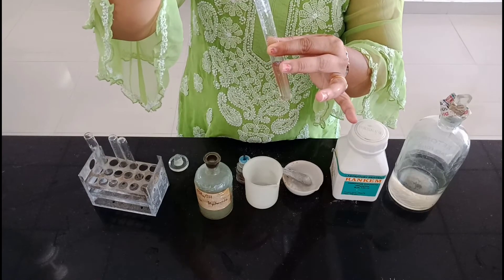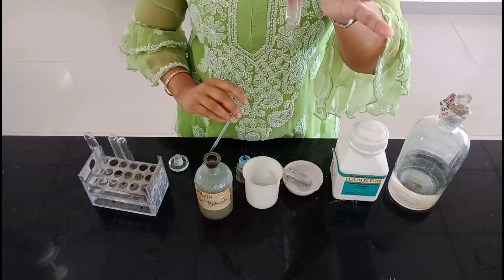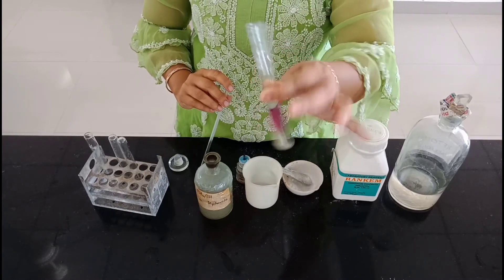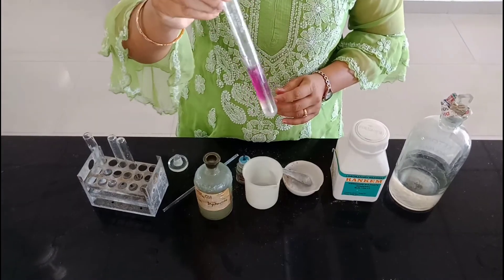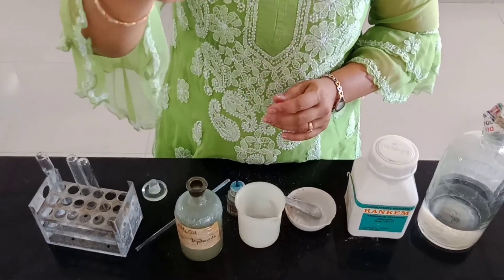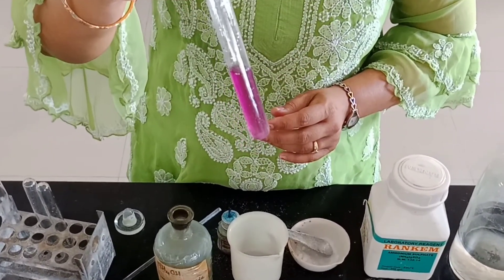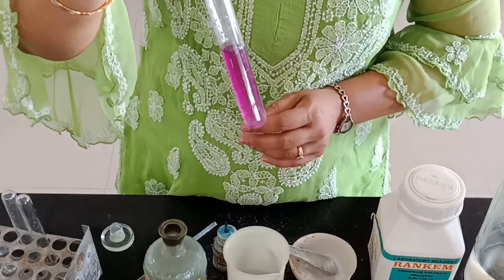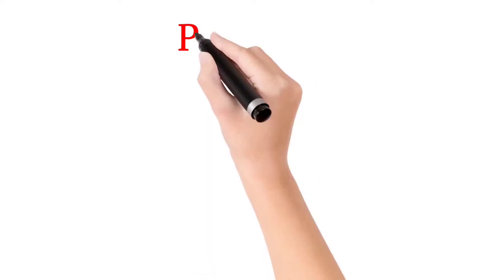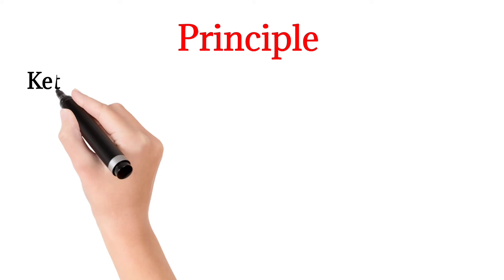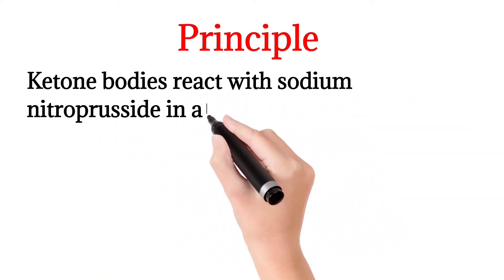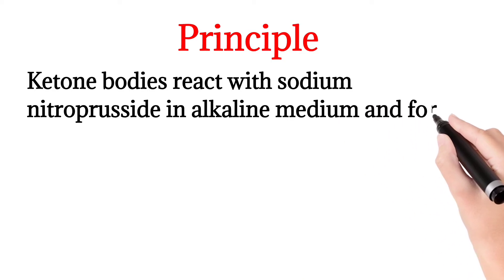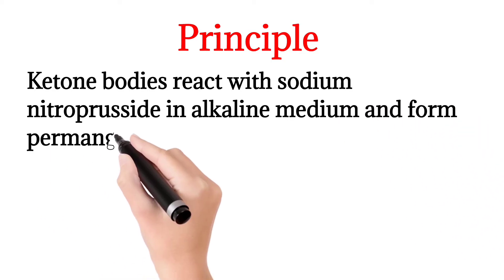If it turns into permanganate color, that means ketone bodies are present in the urine sample. You can clearly see that permanganate color has developed. So the principle is: ketone bodies react with sodium nitroproside in alkaline medium and form permanganate color.